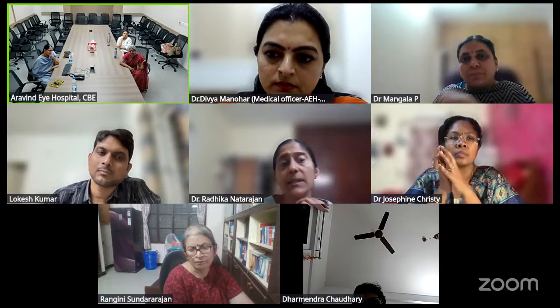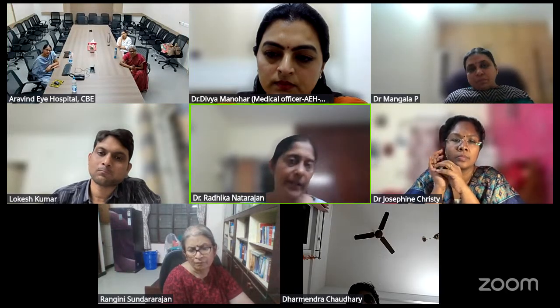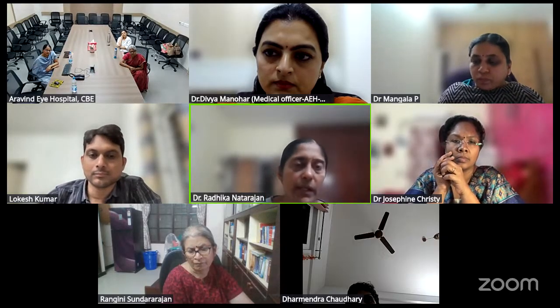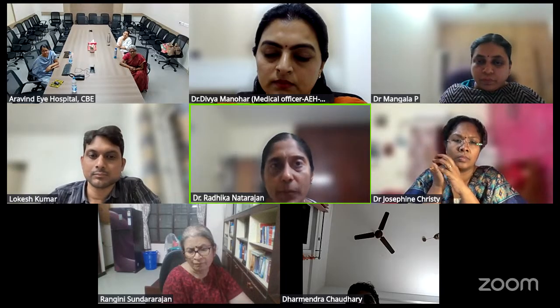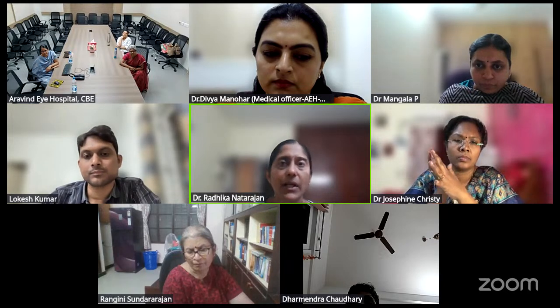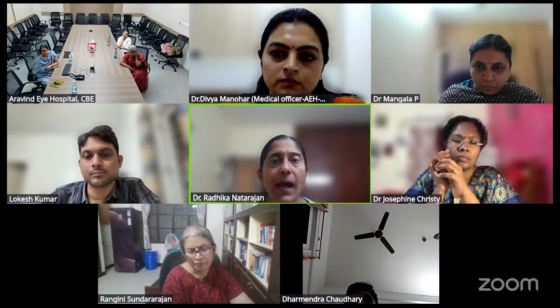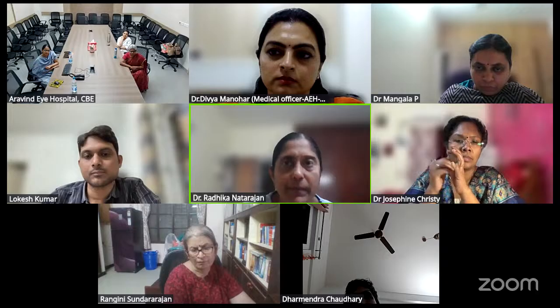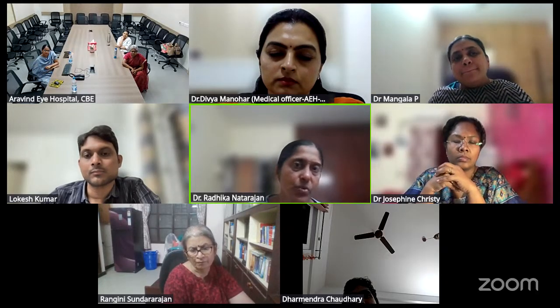Ma'am, I think that is an excellent point that you made. It's a theory that I've had in my mind also. I think sooner or later we should do a study. So let's work it in a reverse manner. We always want to do the corneal tomography and topography in an undilated state. Why do you want to do that? Because we know that the action of the ciliary body and the sphincter of the pupil, etc., have an effect on the peripheral cornea and on the pull on the collagen fibers, right? So that's why we want to do it in an undilated state. So the same logic should apply here also.